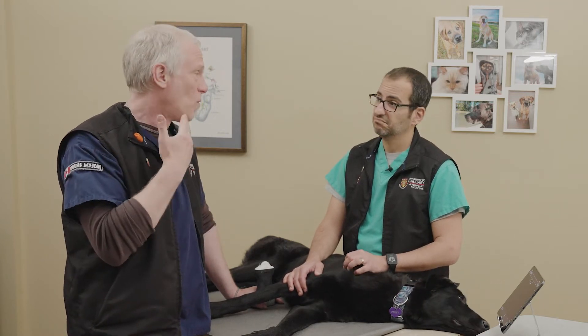In the emergency setting we use this to assess our vessels to make sure they are patent and not thrombosed, and when we get difficult intravascular access or sampling we will use this to find a vein or an artery that we can sample — whether it's arterial blood gas or venous blood gas — and to make sure that we're actually accessing the correct vessel. We'll use this for example when we're doing jugular vein placements or central lines for things like dialysis. That's why we're going to use the vascular access.